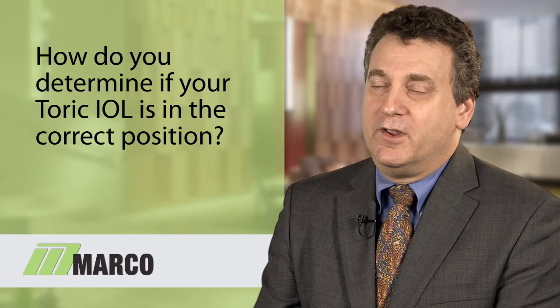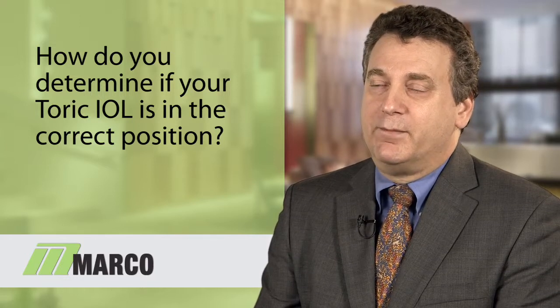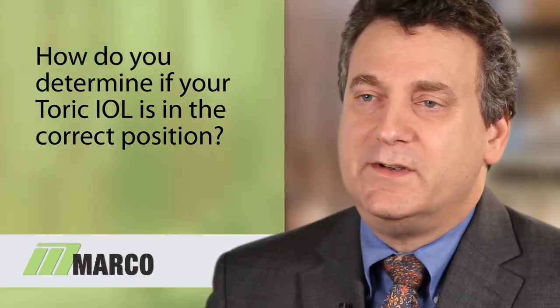But there will from time to time be patients, either in your own practice or that you see in consultation, where their expected outcome with the toric implant isn't as spot on as you want. One of the beautiful things about the OPD3 scan is it allows you to take a retroillumination image that lets you see the toric marks and place on the eye a reticule so you can see the exact axis the toric lens is sitting at.